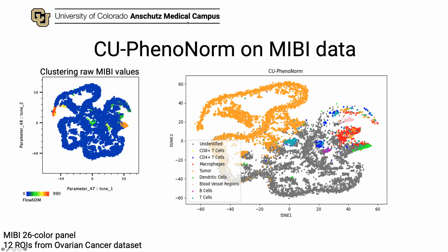Hey, Kim, can I ask a question quick? Of course. How are the cell types identified here? Are they manually chosen markers, or is it automated based on past MIBI data? No, it's a cluster. So all of the clustering is done, and then we go through and look at a histogram of what markers that group expresses, so that we look at each cluster and then figure out what markers those are expressing.